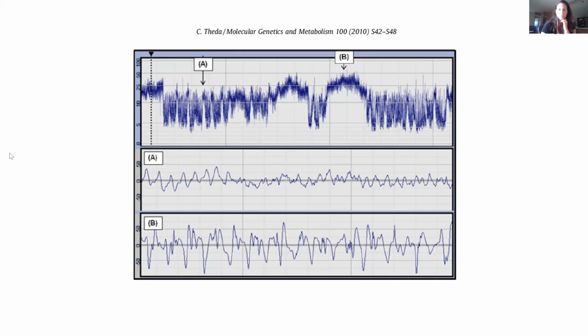So you can see here, this is marked with the A, where the baby's having these short seizures, these quick uprisings, not as well defined to begin, but definitely some rhythmic spiky stuff. And then here at B, look at this very long, almost 30 minutes, right? So if it starts here, 10, 20, oh yeah, at least 25 minutes of this long uprising, and then looking in here and seeing this very classic spike wave pattern.